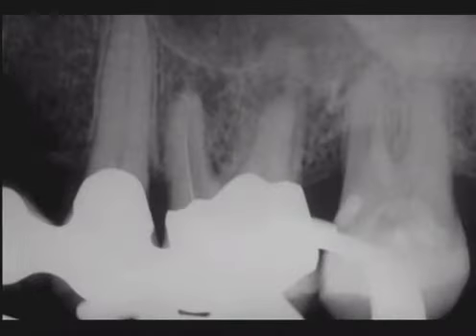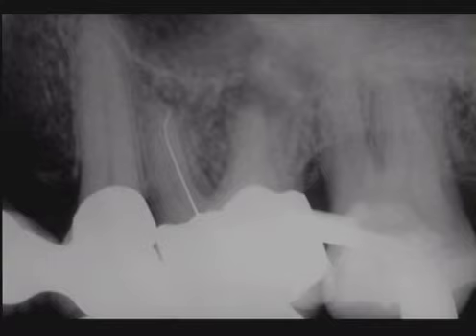In this working film, taken from the distal, you can see we've isolated the MB root more anteriorly. In a pre-flared canal, notice the 10 file working through the MB2 and to length. In another working film taken even more distally to the previous film, notice the secret to endodontic success.